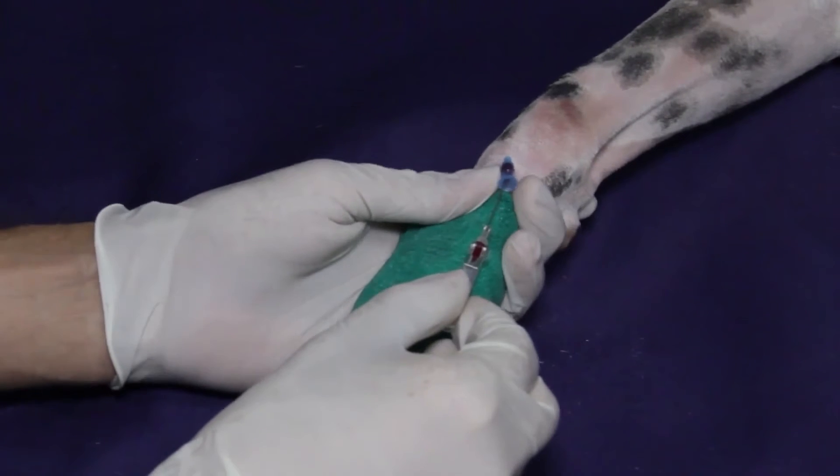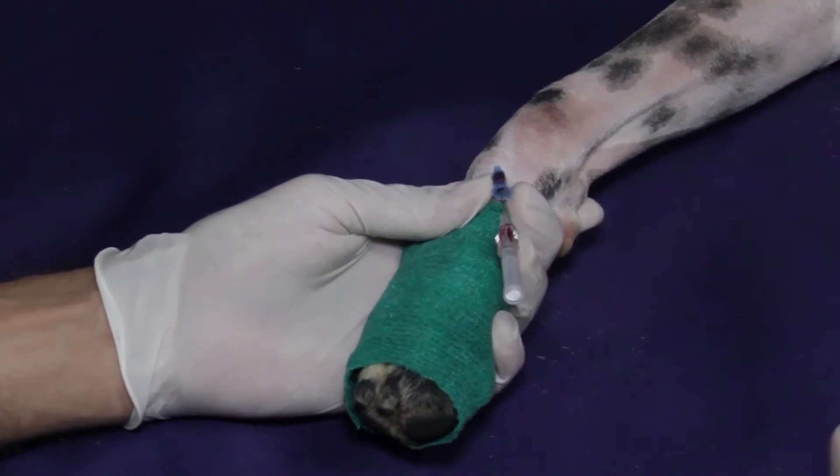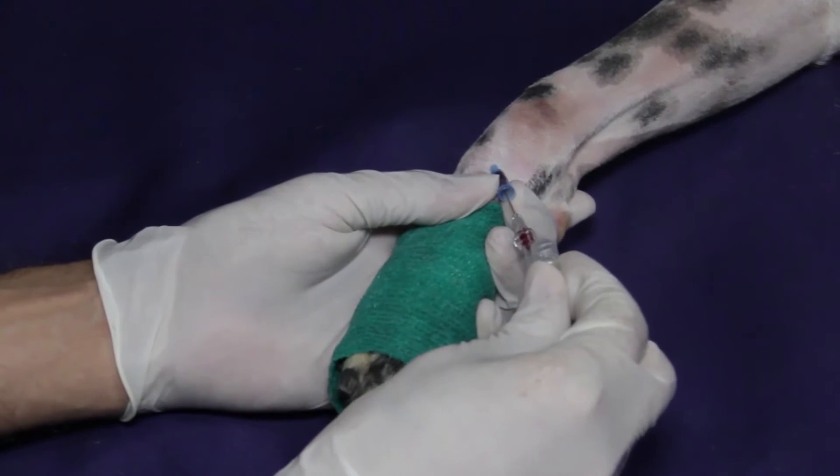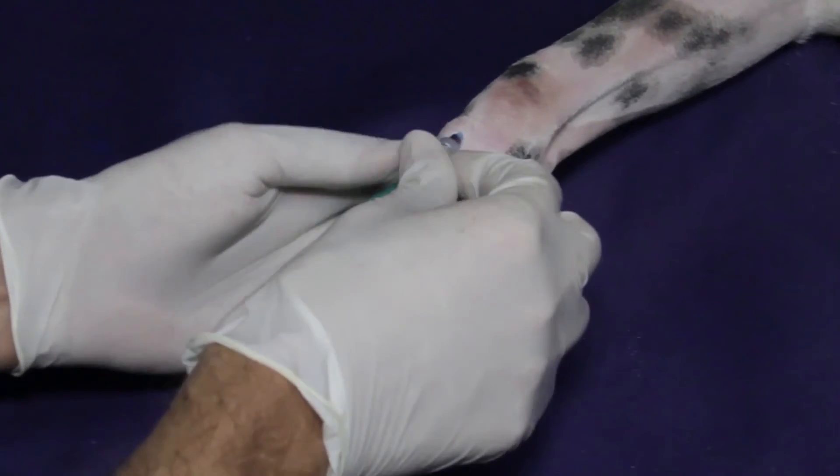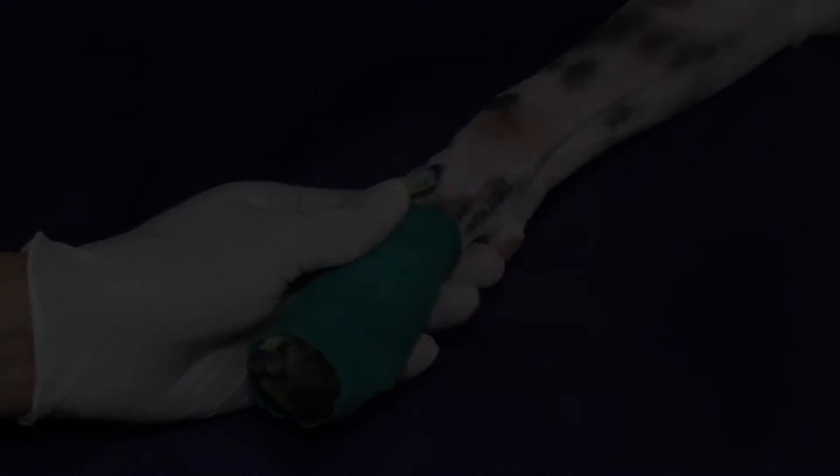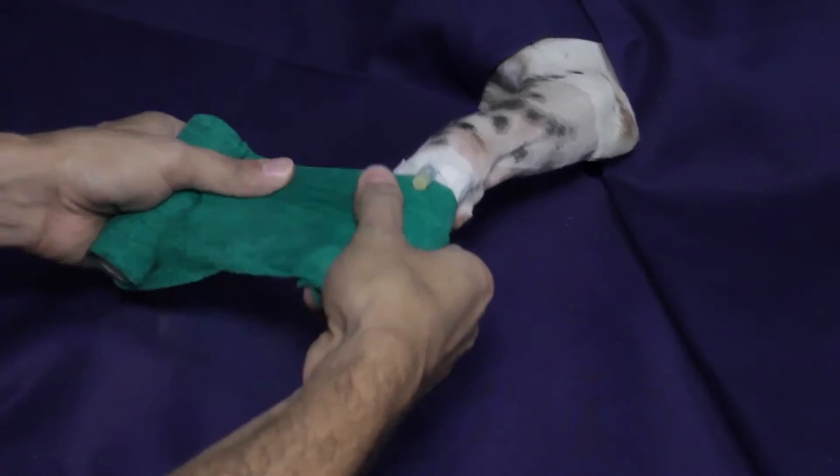As part of a multimodal approach, intravenous regional anesthesia is indicated for procedures involving the distal limb, such as mass removals, biopsies, digital amputation, foreign body removal, and laceration repair. It is preferable to still use general anesthesia when using this technique.